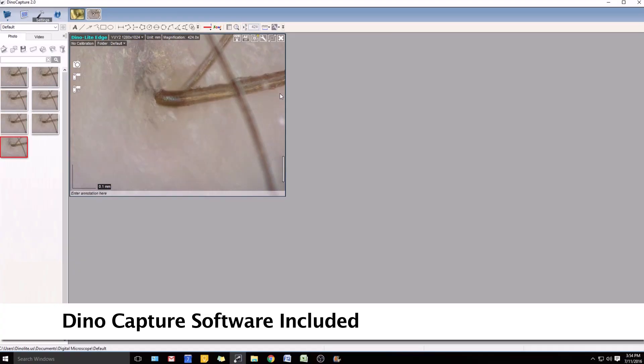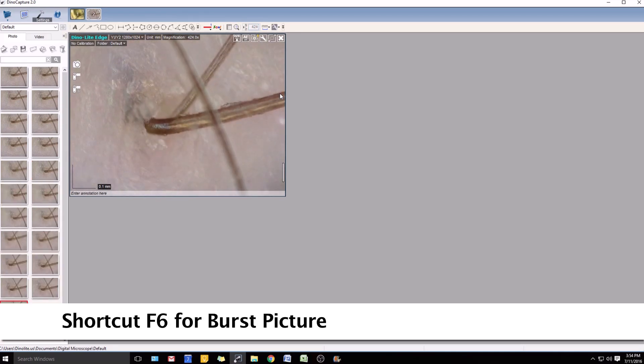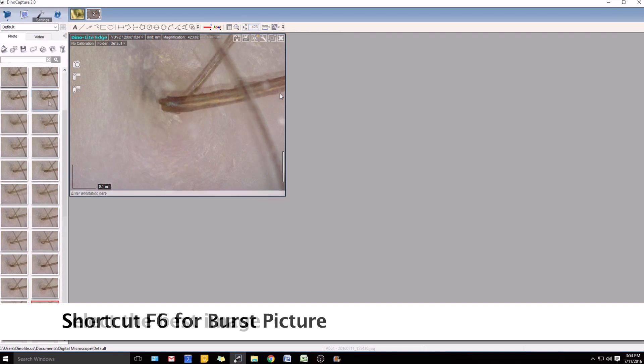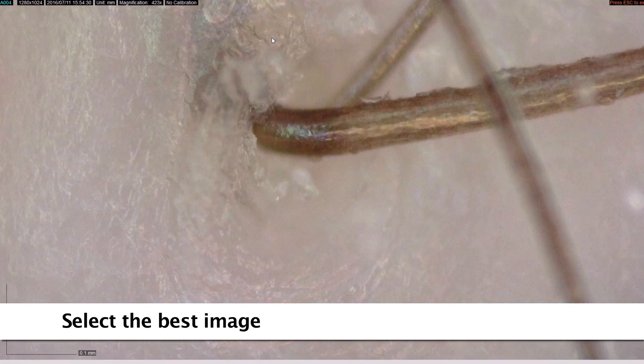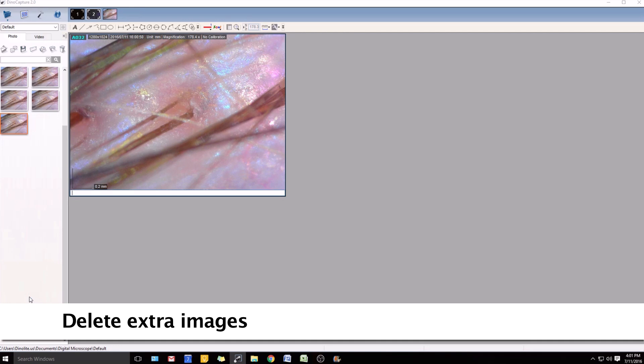The Dynolite comes with easy-to-use software that has many basic and advanced features. The burst mode function helps to capture multiple images in quick succession, so users can then select the best image and delete the rest. This is helpful for getting a quality image from a moving subject.